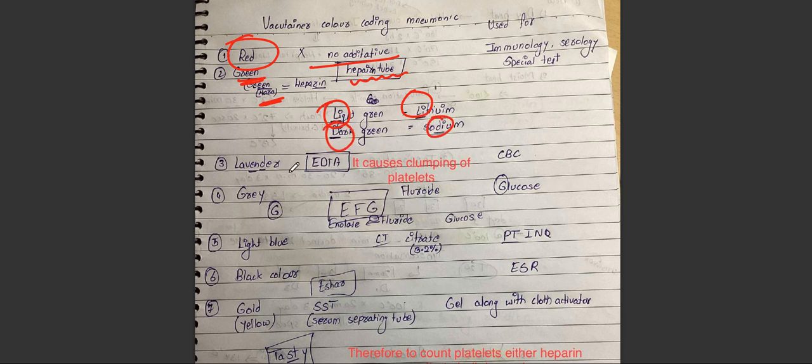Then lavender. Lavender name itself containing E and D, that means the EDTA bulb, and it is used for collecting the CBC. It causes clumping of platelets, therefore it is not used for measurement of platelets. These are the questions of the NEET PG, that which tube does not measure platelet, which is the EDTA tube, which is responsible for measuring the CBC count, everything, but not for platelet because it causes clumping of platelet. Then gray color is EFG, that is E is for the enolase, F is for the fluoride and G is for the glucose.